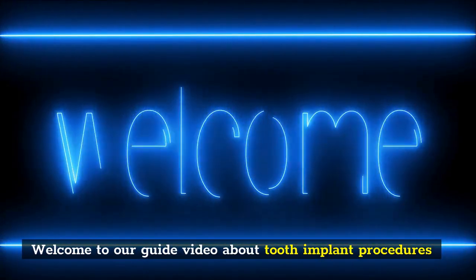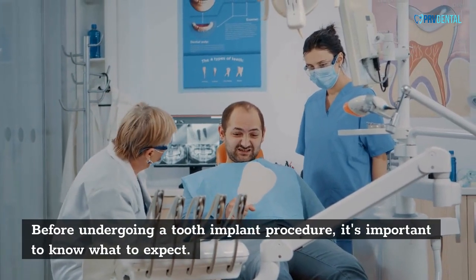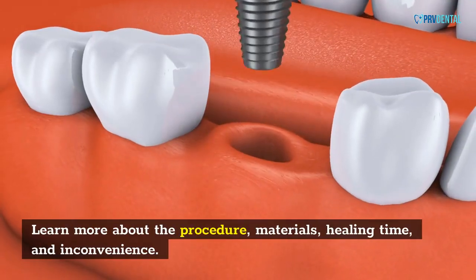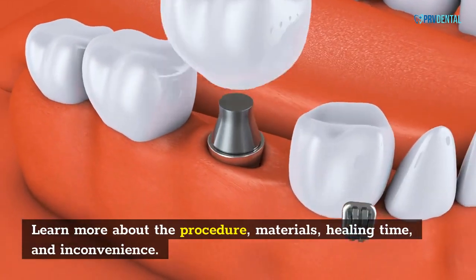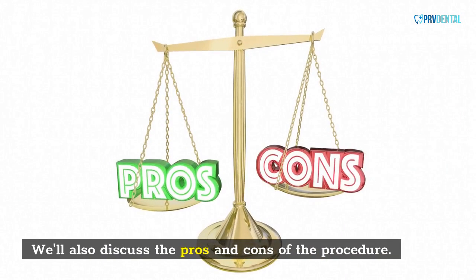Welcome to our guide video about tooth implant procedures. Before undergoing a tooth implant procedure, it's important to know what to expect. Learn more about the procedure, materials, healing time, and inconvenience.